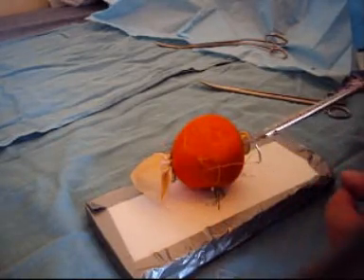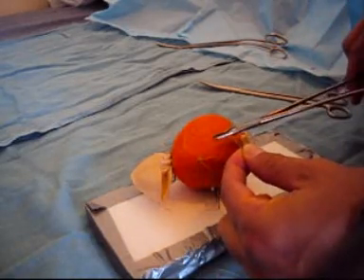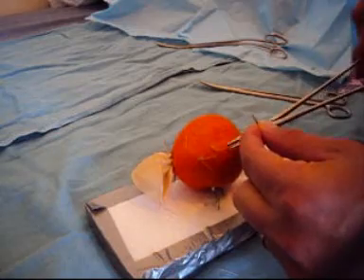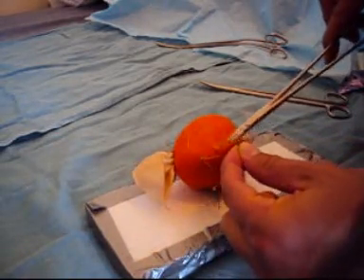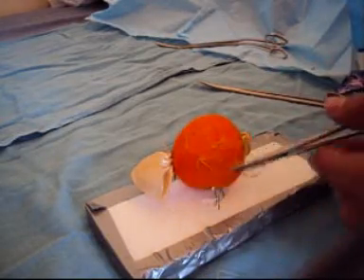As with an open simple prostatectomy, it is important to place sutures within the capsule prior to incision. This is an important principle of the anatomy of this procedure, such that the capsule itself may be incised without causing too much bleeding.